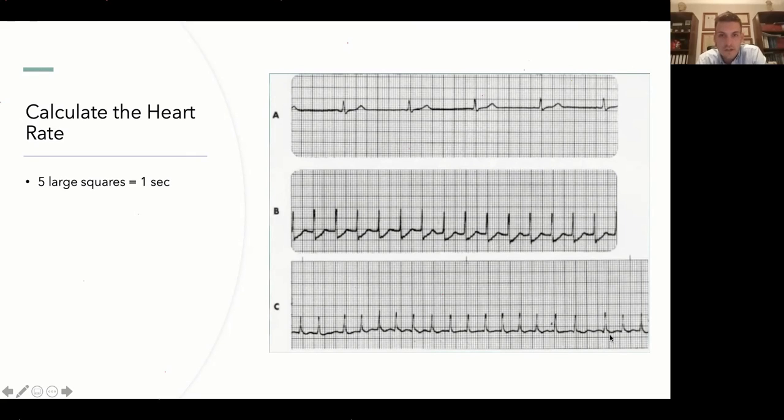Okay, you are actually correct. But you need to explain to me why. Is this regular or irregular rhythm? It is 50, yes, because it's regular. So you can use the 300 rule to calculate the rate, okay? Good. Let's go to B now.